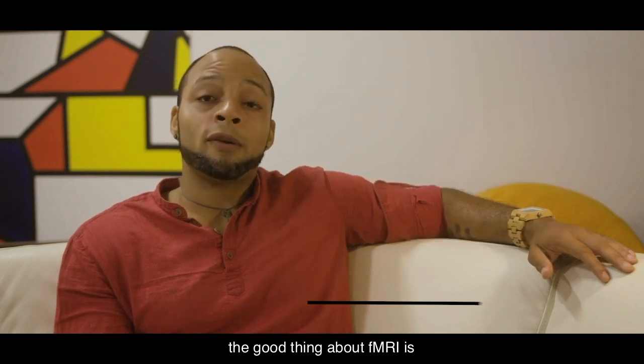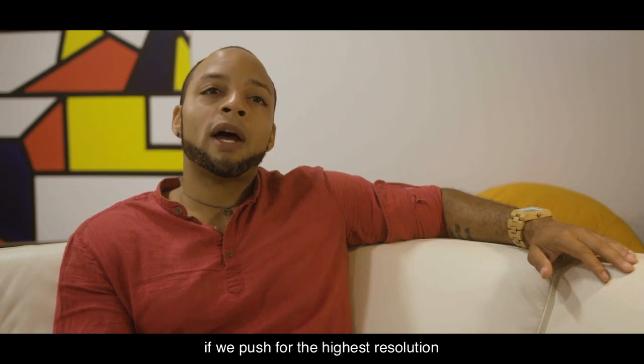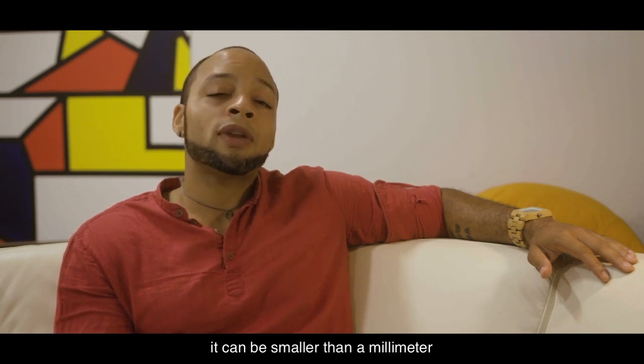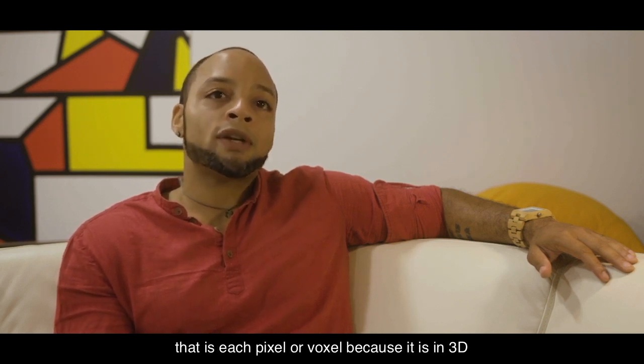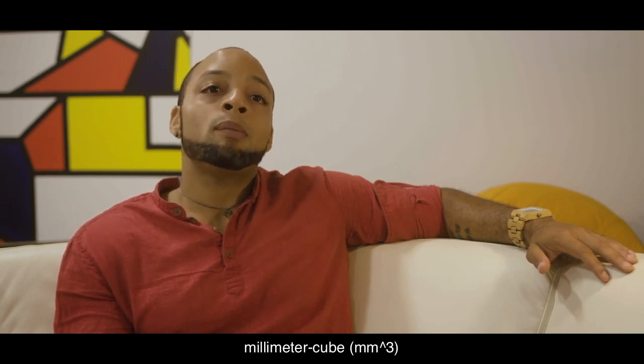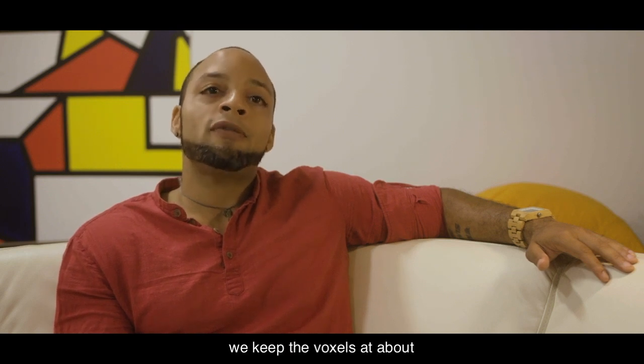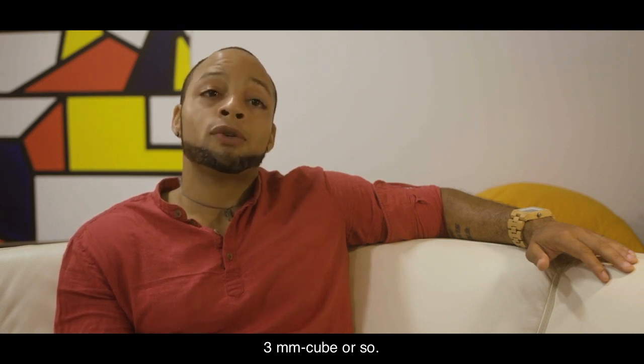The good thing about fMRI is the spatial resolution is pretty good. If we push for the highest resolution, it can be smaller than a millimeter. That is, each pixel or voxel, because it is in 3D, can be smaller than a single millimeter cubed. Though usually, for most purposes, we keep the voxels at about 3 millimeters cubed or so.